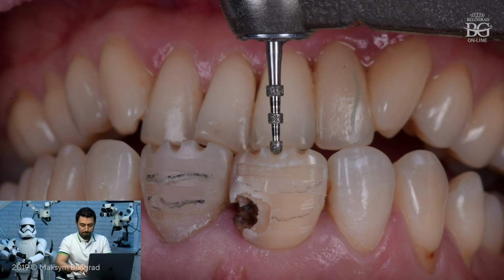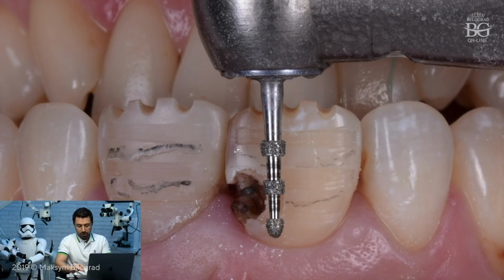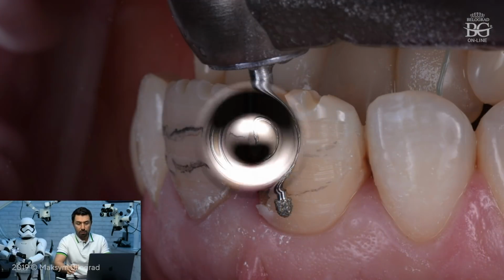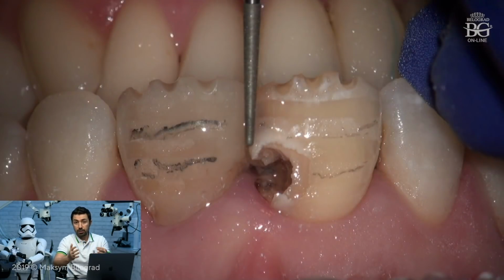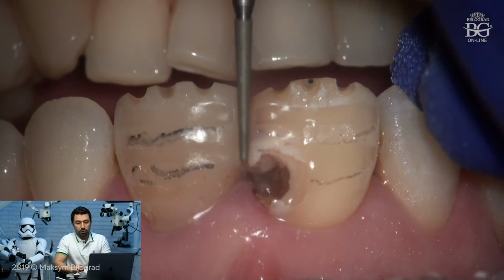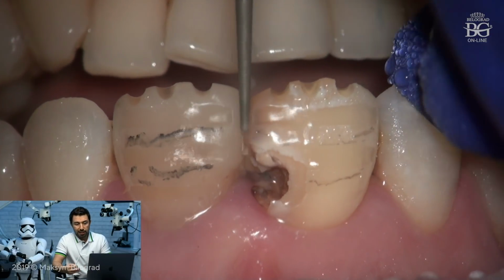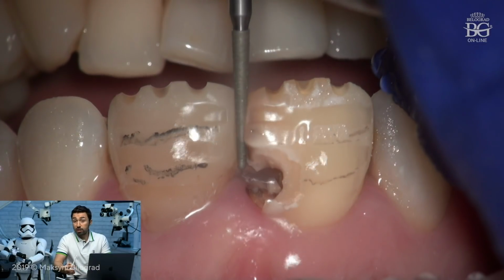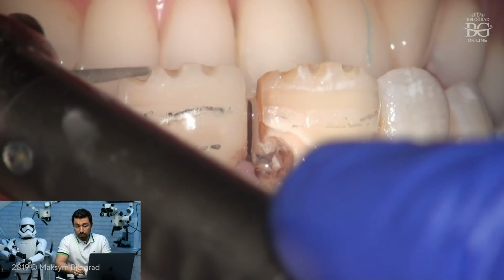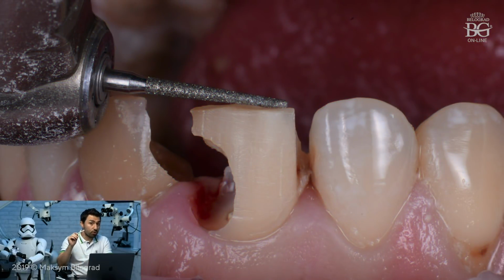And then, after making these grooves, we started with another step of preparation, which was separation and, let's say, the main reduction. The main reduction was done with tapered burrs or cylindric burrs, doesn't matter, with coarse burrs. And also we removed caries during this step of preparation. And only after that we went into the endodontic treatment and then to the final step of preparation.